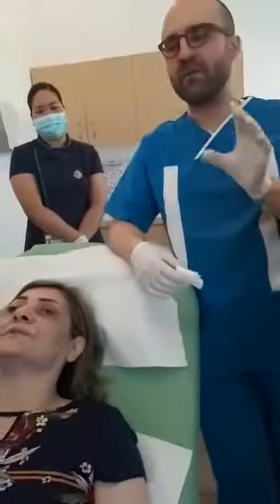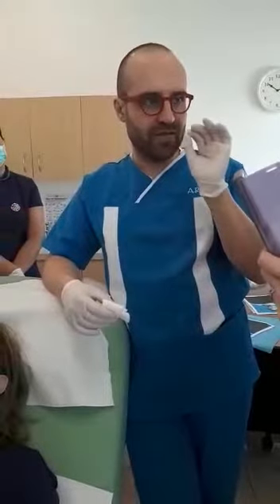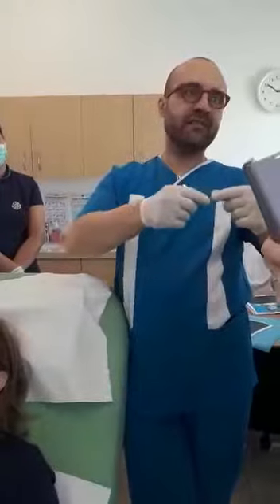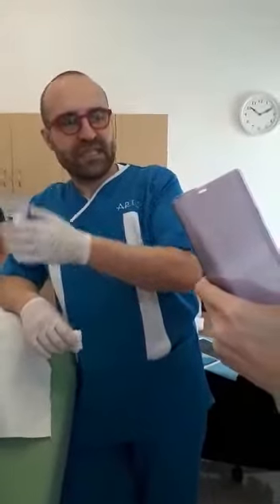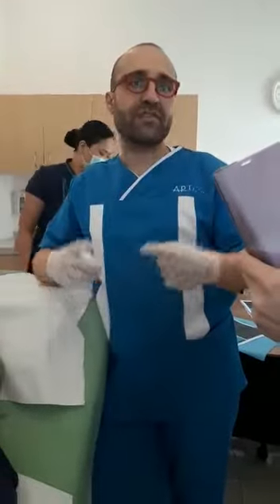Is this permanent? Not at all. Do you mean prolene? No. The thread will last one year? Yes. I'm not saying that the thread will remain entire, it will be in fragments. But polycaprolactone lasts for one year because it's the scaffold we use to have this long-lasting effect.